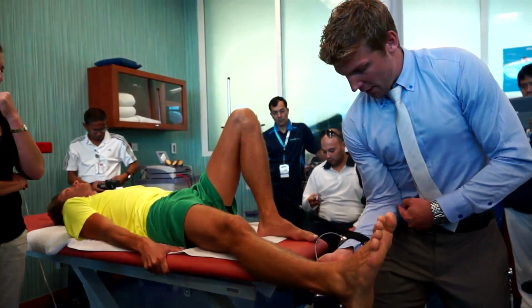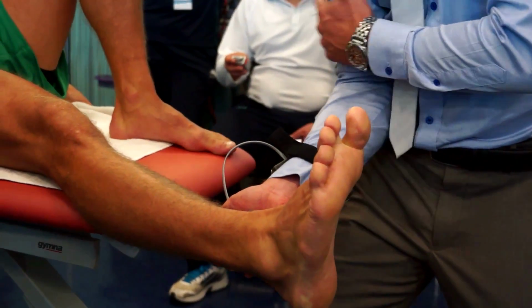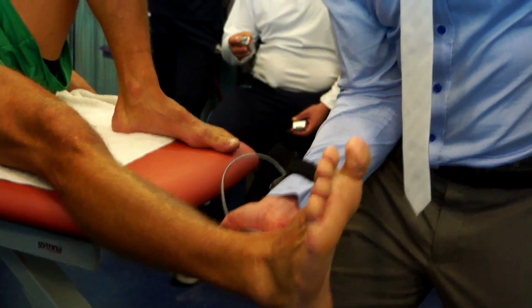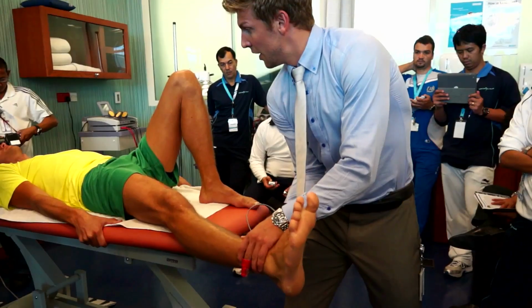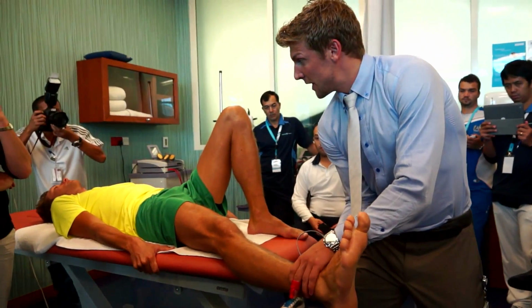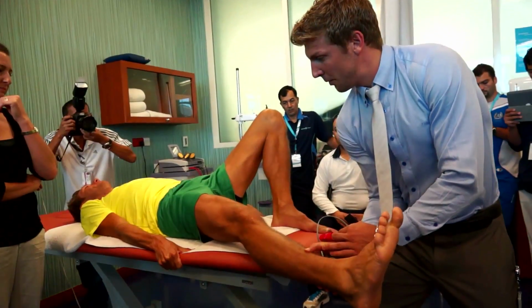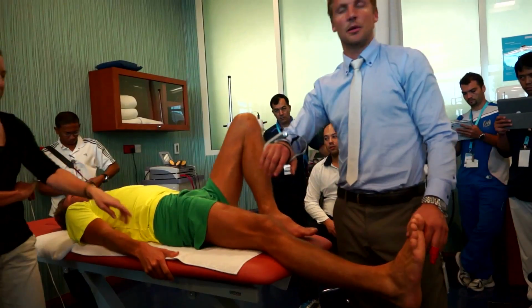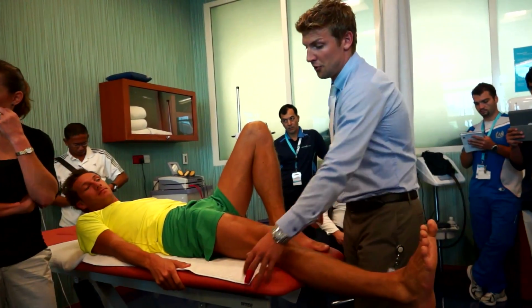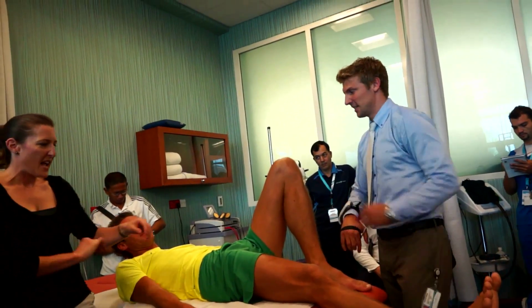You put your elbow on your hip, so that the whole movement doesn't depend on your upper arm strength, but you're just walking forward like this, and you can use the other hand here. And then we'll do the same test. Are you ready? And go ahead. Push, push, push, push. There you go, and then you get another measure. And usually you don't have the towel, so that will make them not slide.